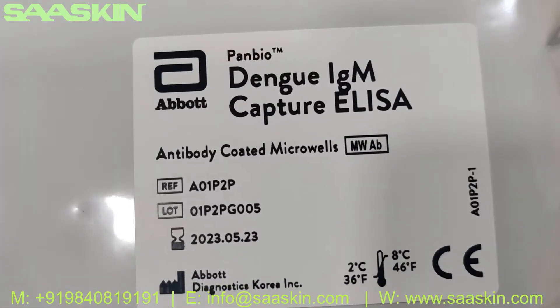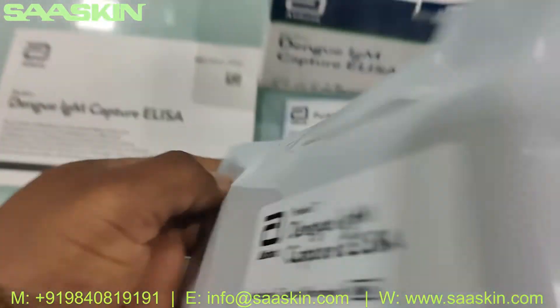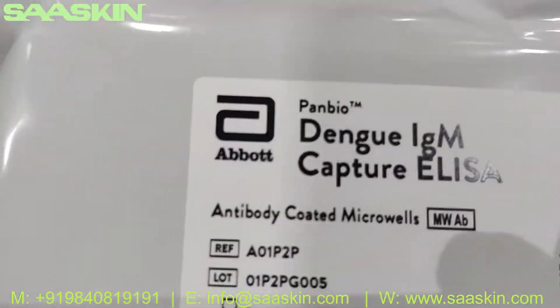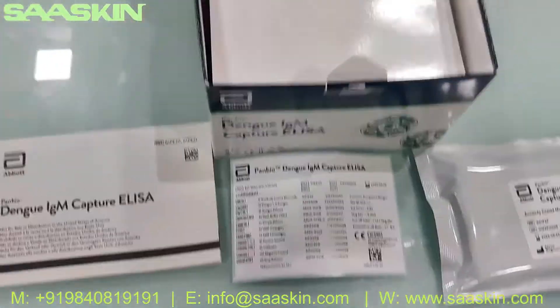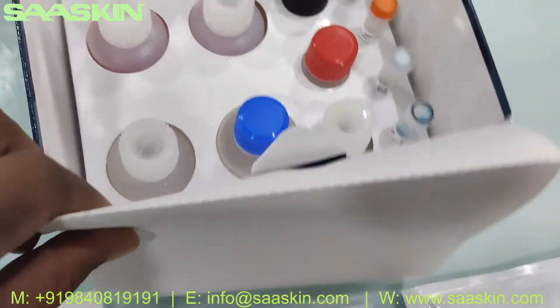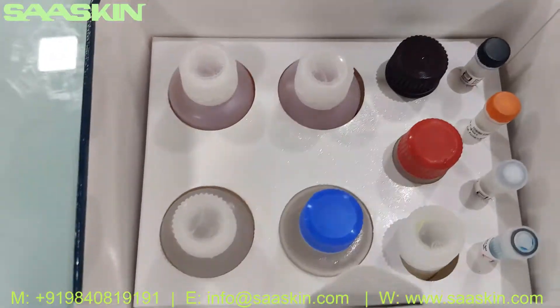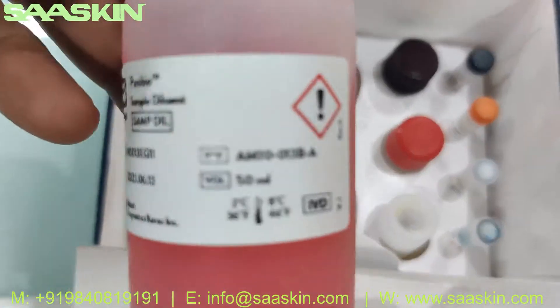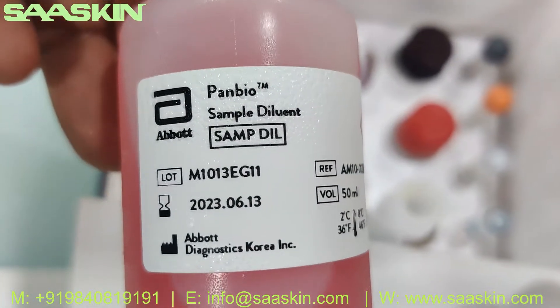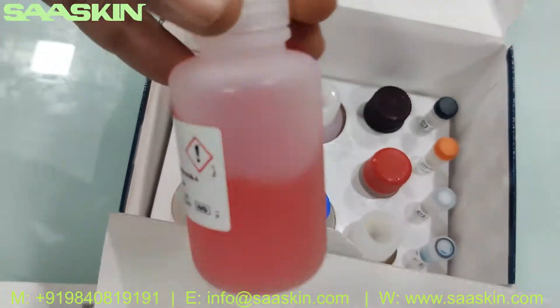You have the antibody coated microwells plate. Let me go one by one through the different liquids. Here you have the sample diluent — this is 50 ml, this is how it looks like.